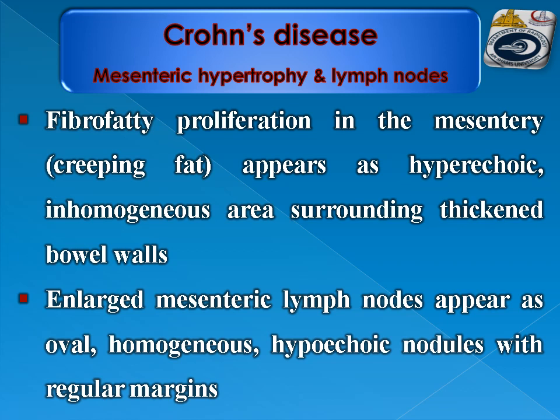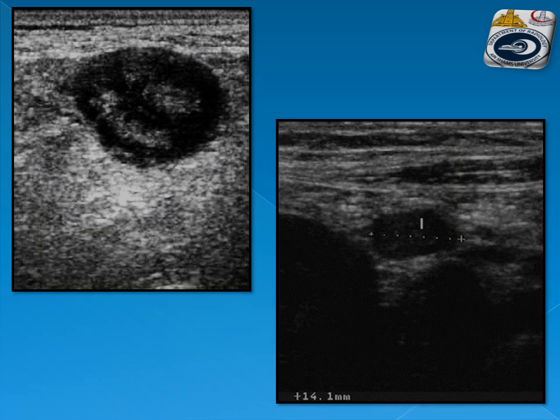Mesenteric hypertrophy and lymph nodes: fibrofatty proliferation in the mesentery, called creeping fat, appears as hyperechoic inhomogeneous area surrounding the thickened bowel walls. Enlarged mesenteric lymph nodes appear as oval homogeneous hypoechoic nodules with a central fatty hilum and regular margins. An example shows enlarged mesenteric lymph nodes with central fatty hilum and hypoechoic peripheral cortex.